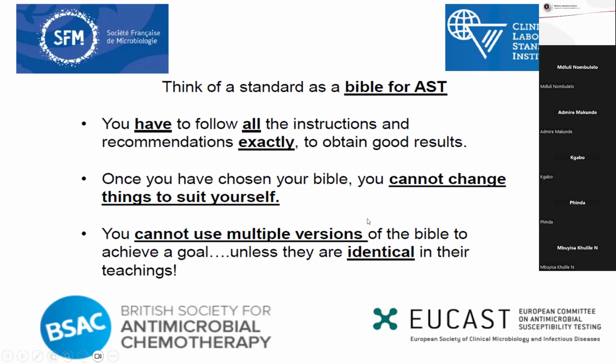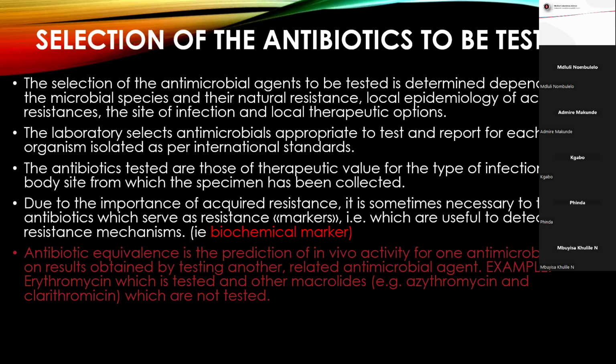You can use it on several platforms, to say you are using automated, you are using this guideline, you are using this method, you are using a different method. You must use a standardized one, and it must be shared with the hospital setting where you are sending the results, because for them to interpret the outcome, it has to be from the guidelines. As I indicated earlier on the selection of antibiotics, it depends on the bacteria isolated, whether it's natural or acquired. So that's the first thing to say.